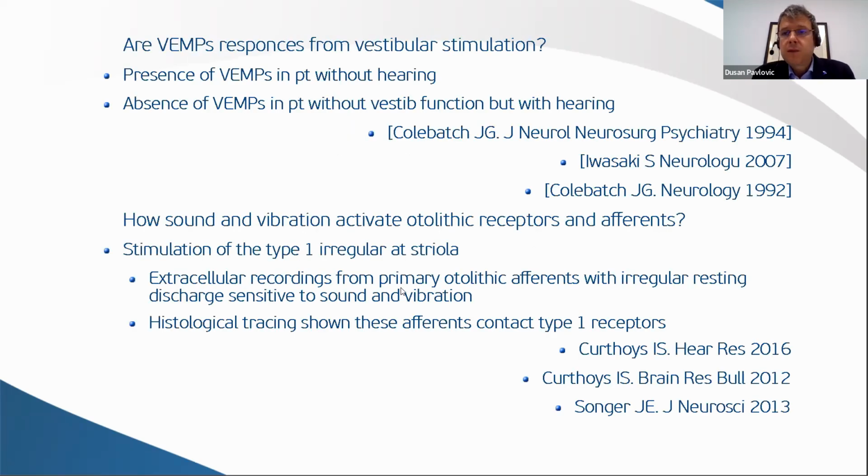So how can we know that the response which we measure is not from the cochlea? How do we know it's from the vestibular part? Here are some studies which demonstrate that we can record vestibular evoked potentials in patients with a deaf ear.